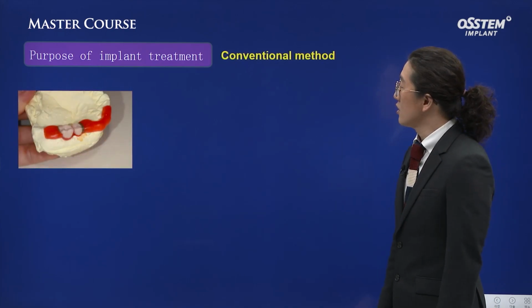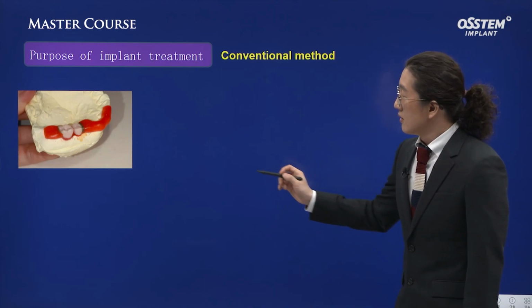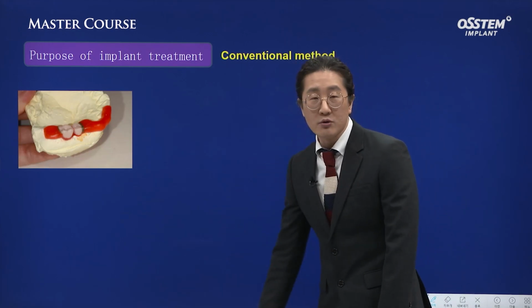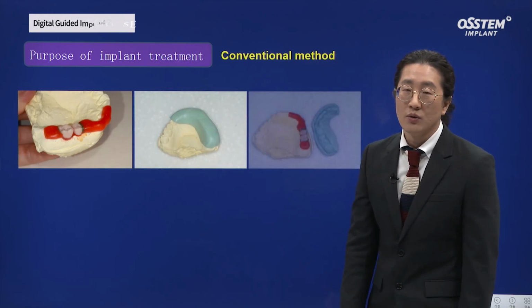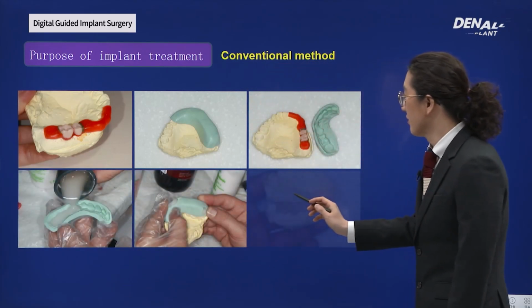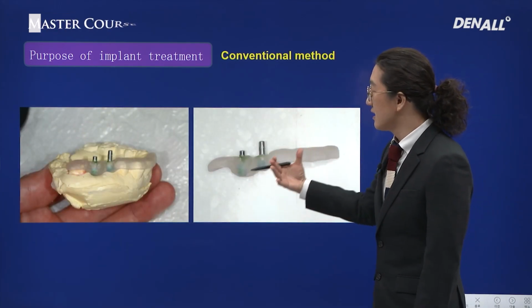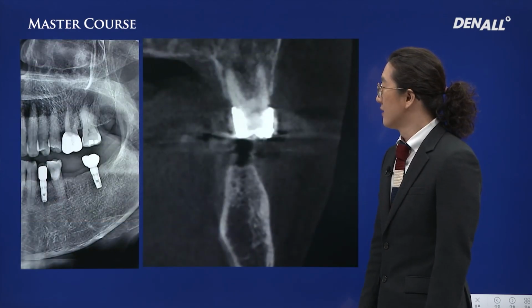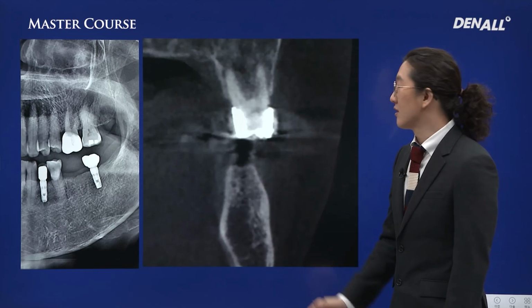In order to provide a top-down treatment plan, we provided this kind of treatment before digital dentistry emerged. On the model, in the desired position, crowns were aligned, and putty was used to make scaffold. Resin for orthodontics was used to fabricate guide like this. Analog guides were used for surgery. It was severely oriented around the crown.